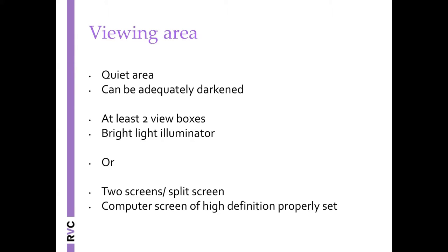Nowadays a lot of practices and universities have digital systems. If that's the setting, two screens will be ideal. If you don't have two screens but have one big screen, you can always use a split screen to display two views. It's always a good idea when you see an organ or lesion to evaluate it on both one view and the orthogonal, so you get in your mind where that is in a three dimensional setting.